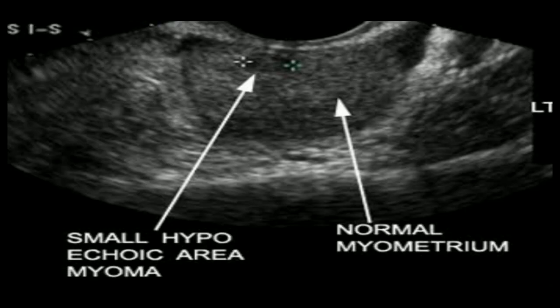This is very important to know. If we look at this diagram — this ultrasound of one patient — you can see the normal myometrium at one place, and also a small hypoechoic area of myoma. That hypoechoic area is most probably the uterine fibroid.